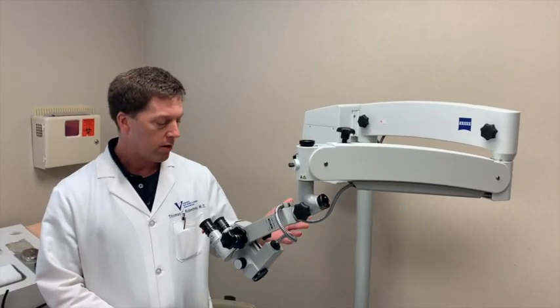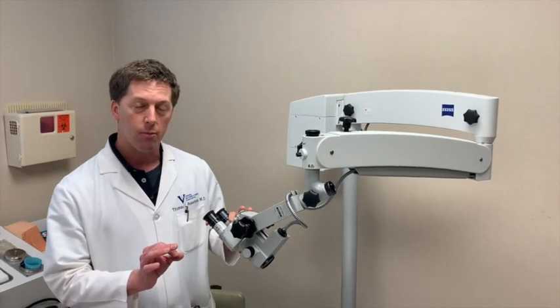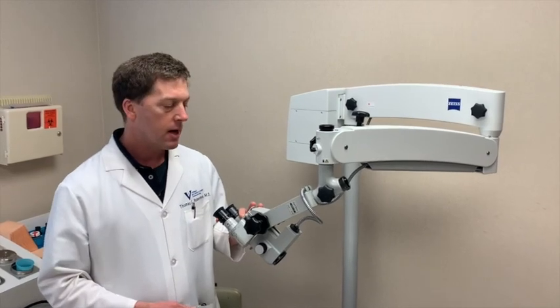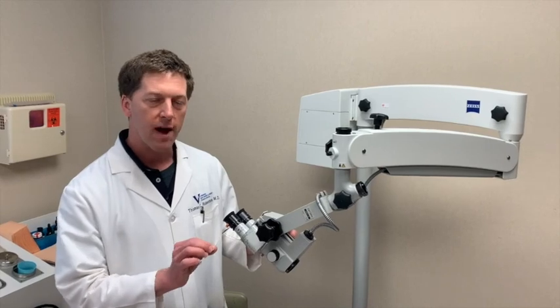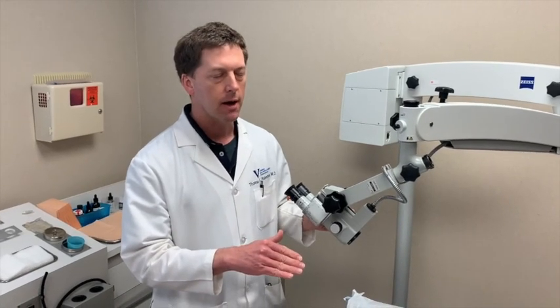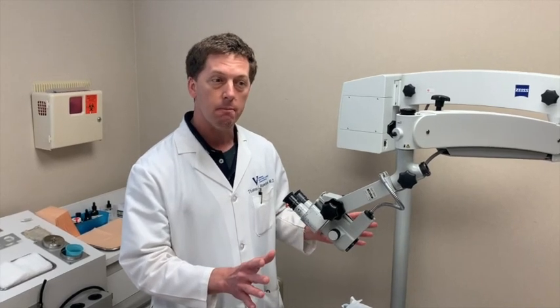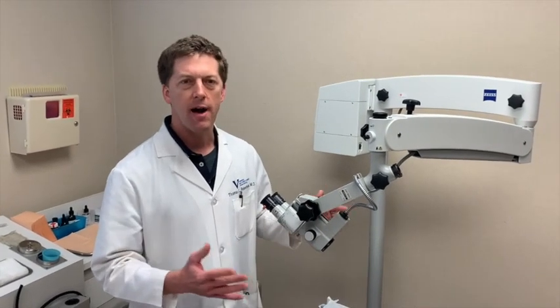Very simply, we are going to look at the ear under the microscope and really visualize that eardrum well. If there's wax in the ear, we'll have to clean that out first. Then once the eardrum is visualized, we can make a very small incision through the fibers of the eardrum just to get the fluid out of the middle ear, and then the tube slips right in. Very, very easy. Once the tube's in, a few drops go in the ear to prevent any blockage of the ear tubes themselves, and then we turn the gas off and wake the kids up. Maybe about 5 to 10 minutes.